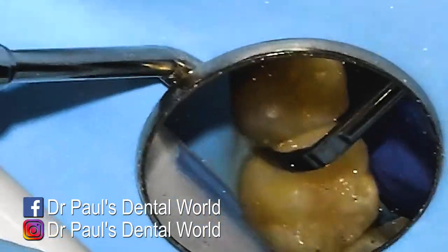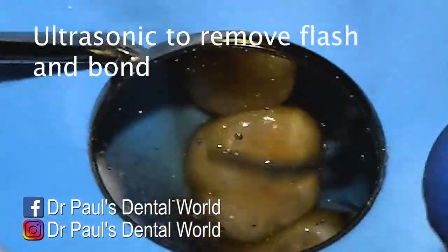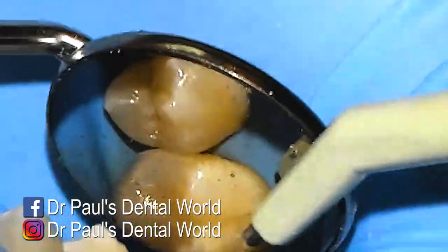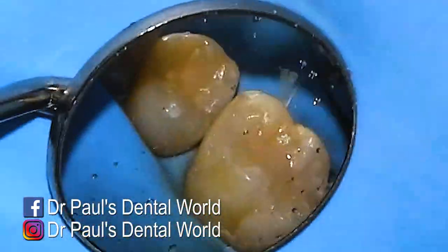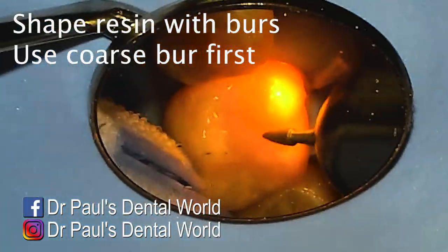This full cure is actually a three-second cure with a high-powered light, so I always do that at the end. Then I'll go around with my ultrasonic making sure I get rid of any bond that might be on the tooth or on the tooth next door that might affect the occlusion, and then I'll see the areas that I need to be finishing and shaping.